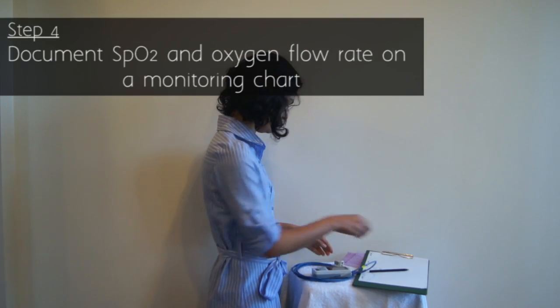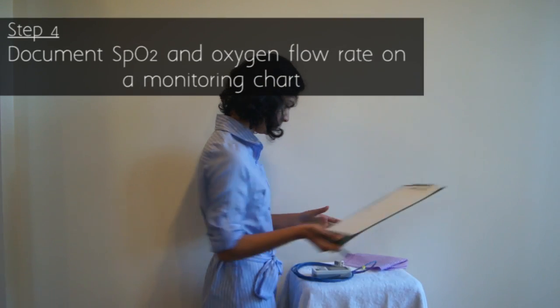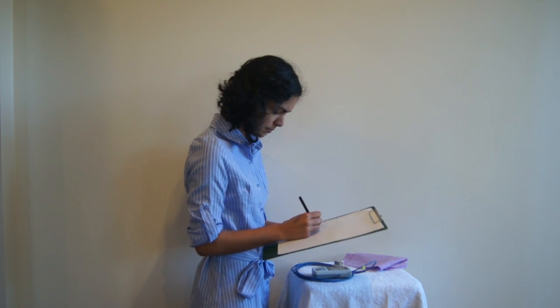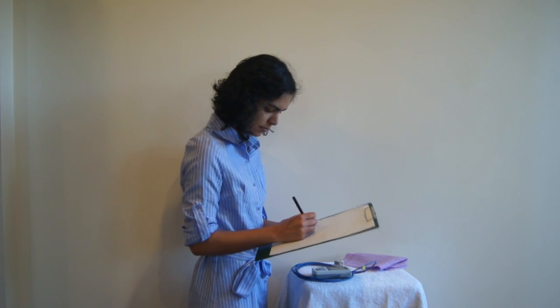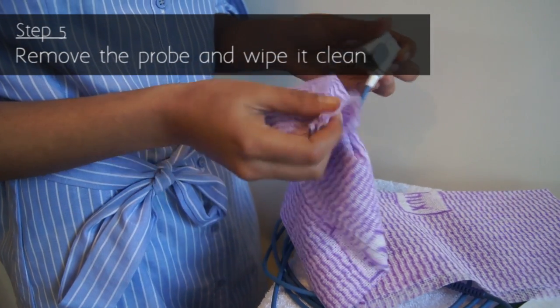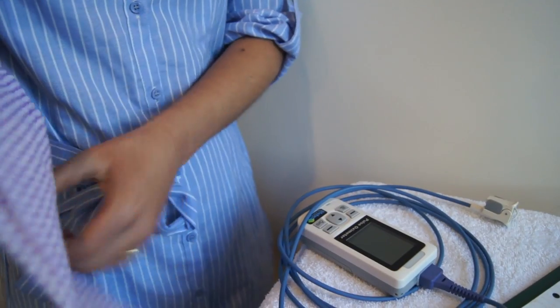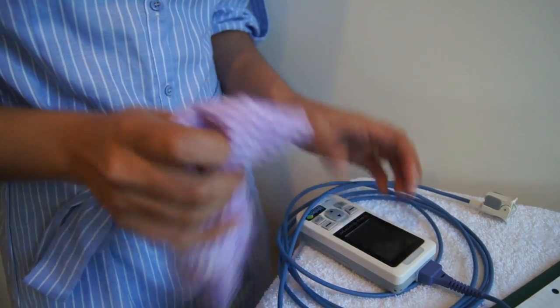Record the oxygen saturation on a monitoring chart. If the patient is on oxygen, record the oxygen flow rate and whether it has been changed. Finally, remove the probe and wipe it clean before using it on the next patient. The probe is the most delicate part of the oximeter and needs to be looked after carefully.